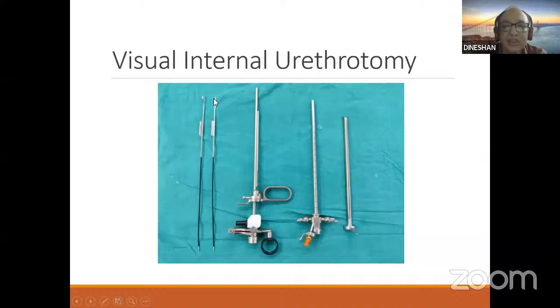You pass it through the stricture, and with a downward movement of this proximal end, you elevate the tip of the knife and cut.